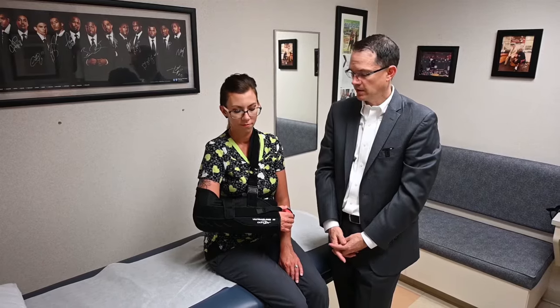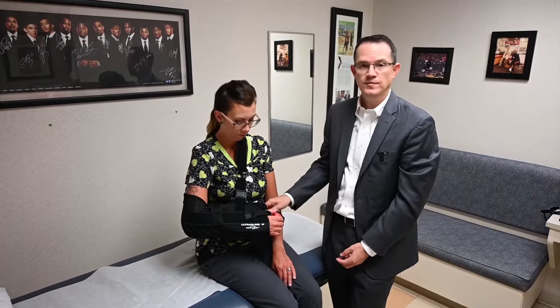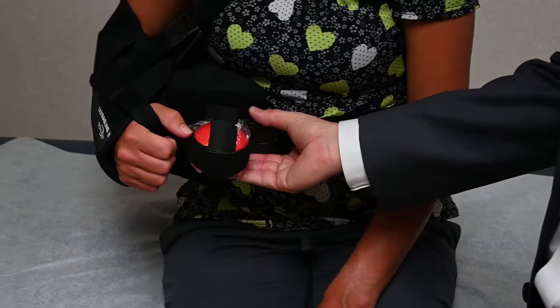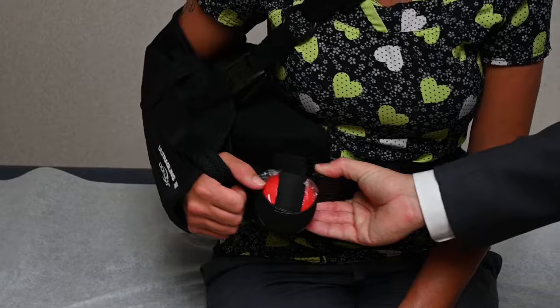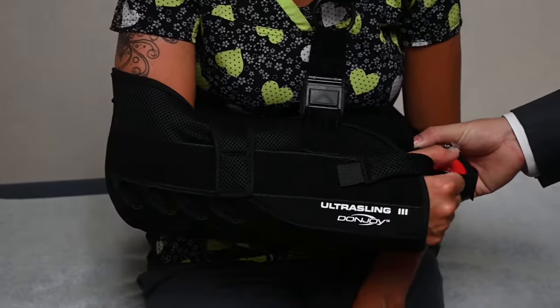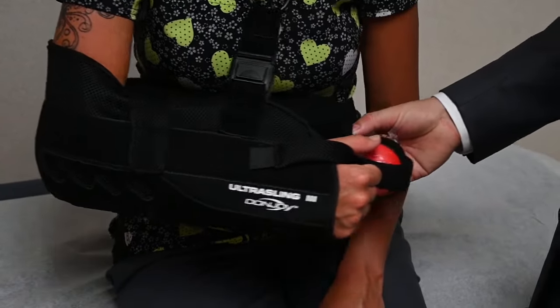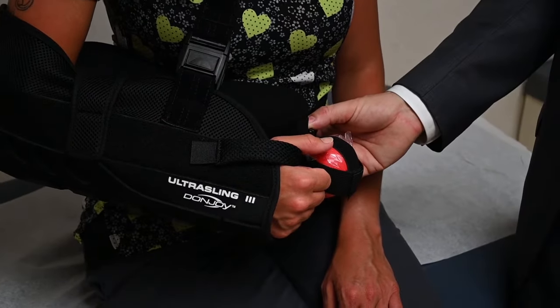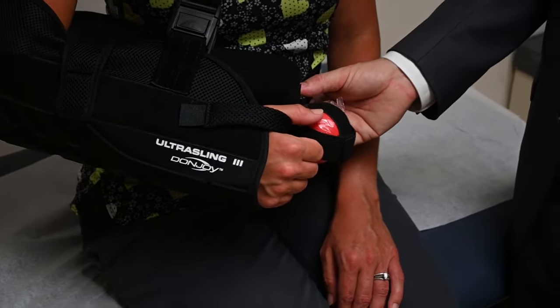The second thing to look at is the strap around the waist. Patients often ask whether the pillow should be all the way to the side or all the way to the front. As a general rule, place the pillow about halfway between the side and the front in a comfortable 45-degree position.